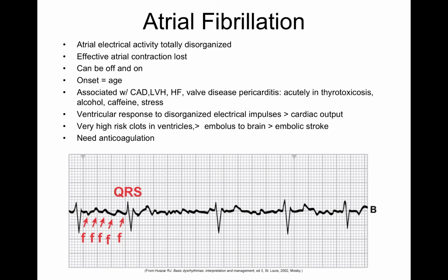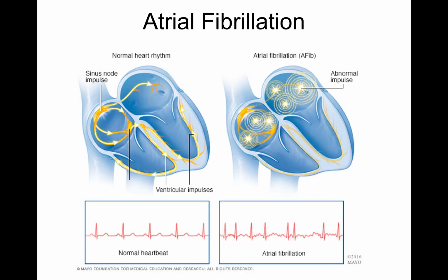Another thing too is you can have atrial fibrillation with SVR, slow ventricular response, and that's typically an AFib rhythm that's less than 60 beats per minute. Most of the time, atrial fibrillation rhythms are between 60 and 100 beats per minute. They're usually irregular. What you're going to see on the cardiac monitor is that it will say 62, and then 82, then 70, then 90. The heart rate is going to vary. Also, as you're feeling for a pulse, when someone's heart rate is irregular, that should tie in that they might have atrial fibrillation.